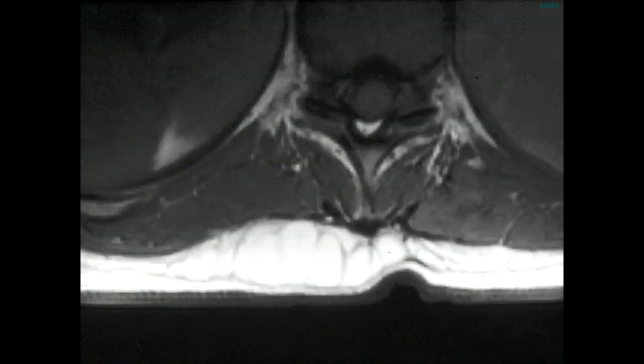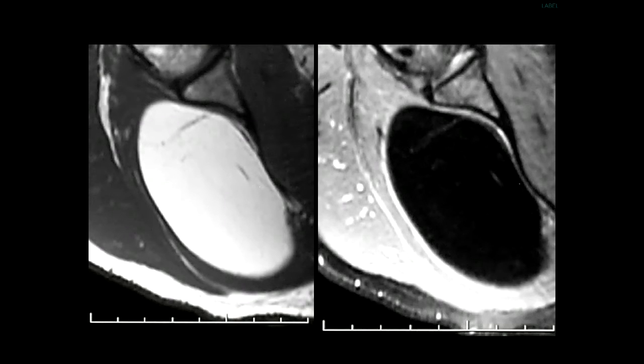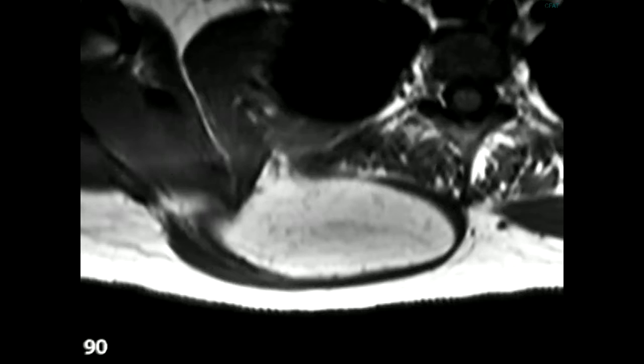So just by way of example, we have this patient who comes in with a paraspinal mass, and we can see this lobulated mass in the paraspinal area with a signal intensity which is identical to that of the subcutaneous fat, and certainly it was that way on all pulse sequences, and we can make the diagnosis of a lipoma based on the signal intensity. And here, an intramuscular lipoma, again with the signal intensity of the lesion mirroring that of fat on all pulse sequences. Here, another patient, this one who is being done with a surface coil, and we can see what looks like somewhat dirty fat, but notice again the same distance from the coil, the exact same signal intensity, and this is an intramuscular lipoma based on its signal intensity, intramuscular on its location, which was confirmed at surgery.